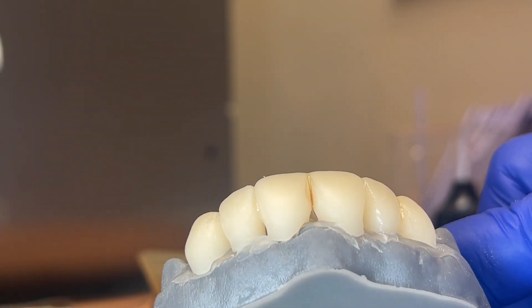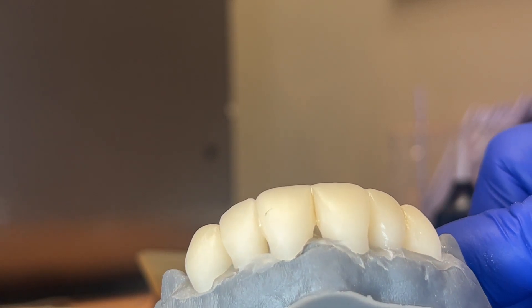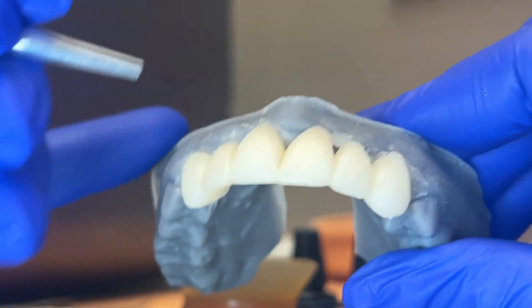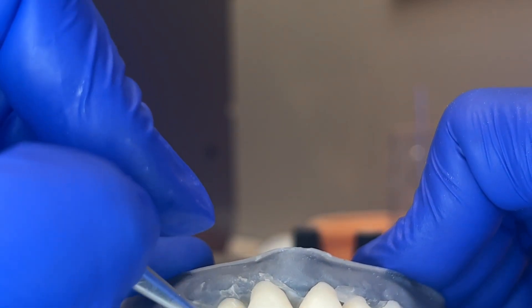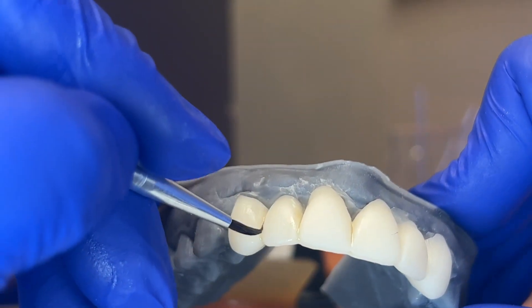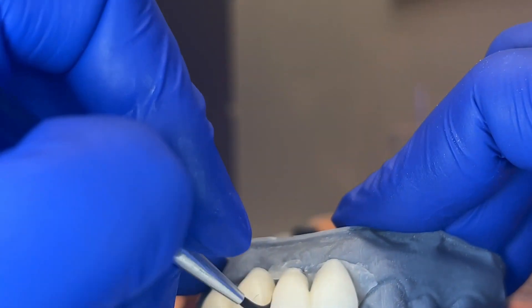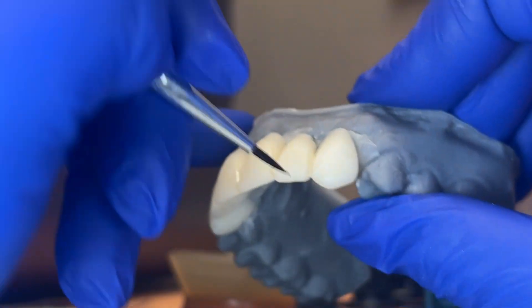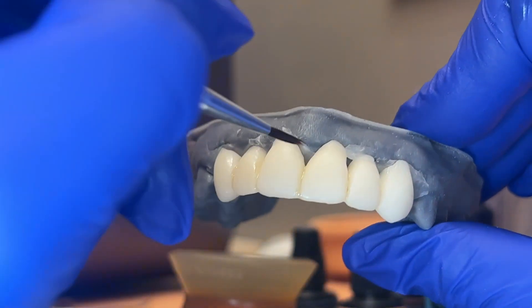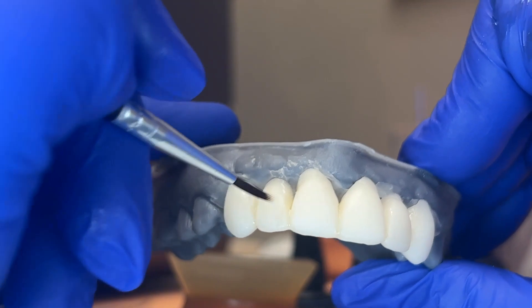Even just a little bit — that tiny bit of separation makes the difference. Use a dry brush if it's a little too heavy, and I just want that little bit in between those teeth. It's mounted on here with some old wax. I don't want it too thick or too thin, just enough to separate the teeth a tad.